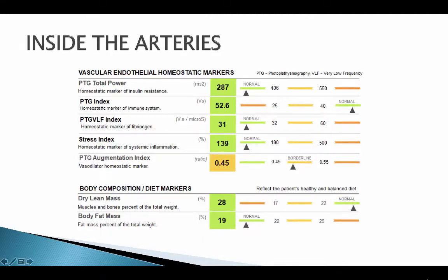The TM Flow machine will look inside the arteries and tell you if the person is prone to diabetes with insulin resistance, has a decreased immune system, or shows signs of inflammation. This is a normal result on a young, healthy person — they don't have signs of inflammation, increased insulin resistance, or a depressed immune system.